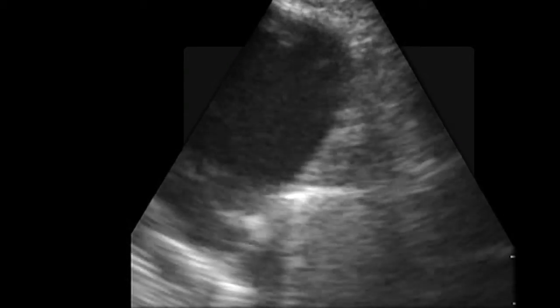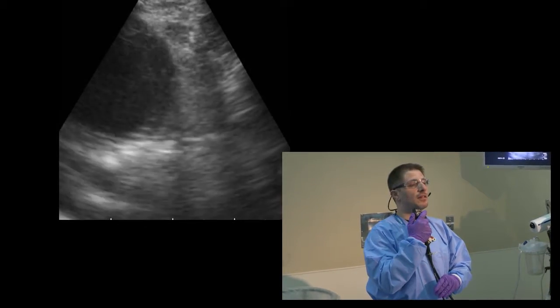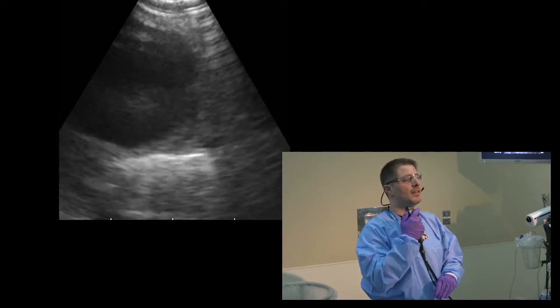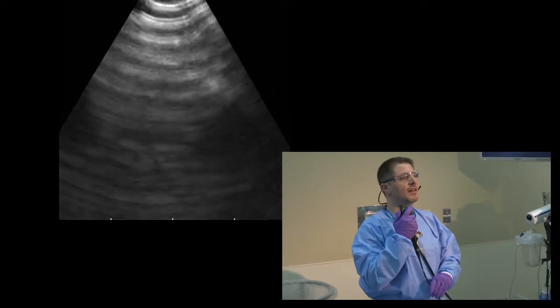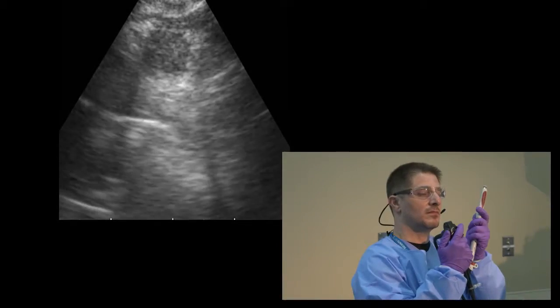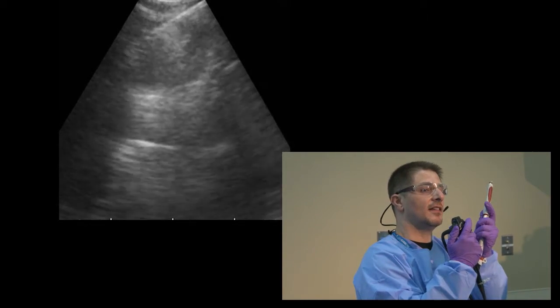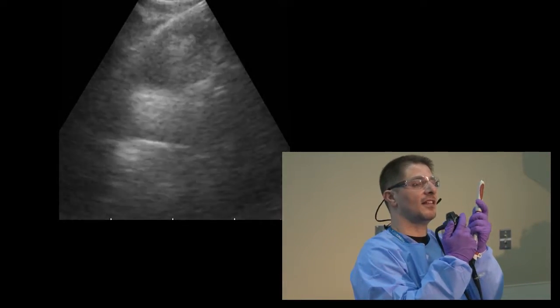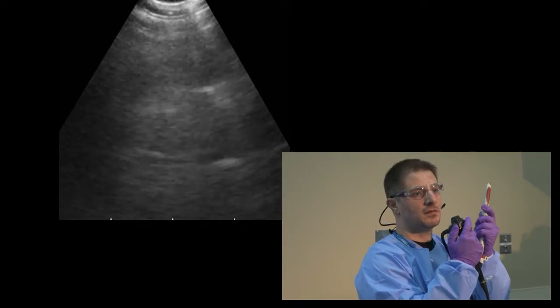Pulling back now, sliding up toward the head, you can see there is a lymph node coming in front of us. This lymph node is between the pulmonary artery on the left side of the screen and the aorta, which is on the right side of the screen. The lymph node is 4L, as you see here. You identify the lymph node, and the needle is now inside it. It's a tough angle, that's why the view of 4L in this situation is not that good. The most important thing is to do your sample from edge to edge of the lymph node.